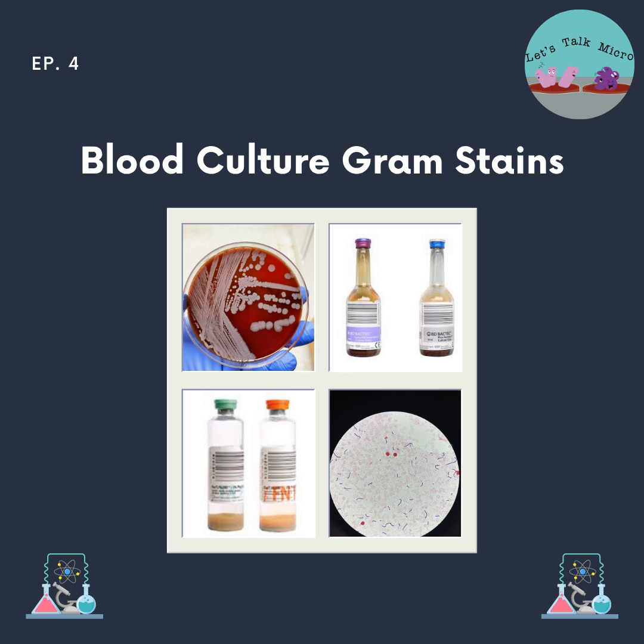And how do we know if the bottle is positive or not, if an organism is growing? Well, I'm just going to put this in very simple terms. Carbon dioxide, or CO2, is produced by bacteria, and this causes the pH to lower. This change is detected either by fluorescence or a colorimetric method. That is when the instrument flags it as positive.